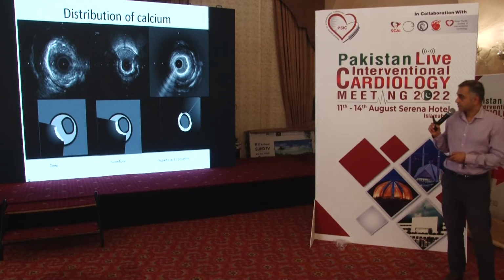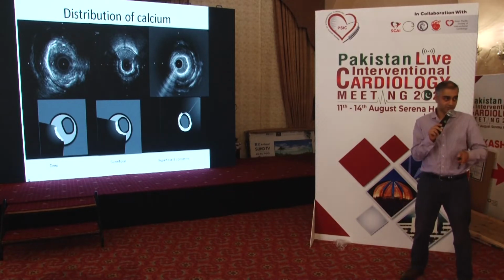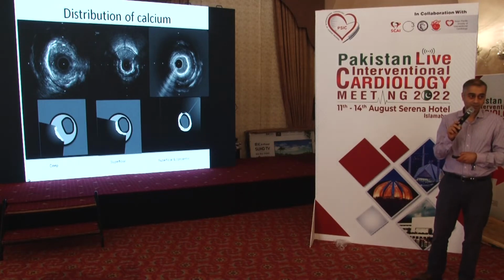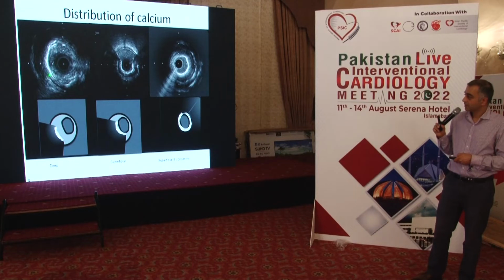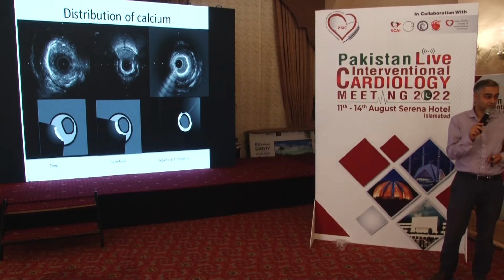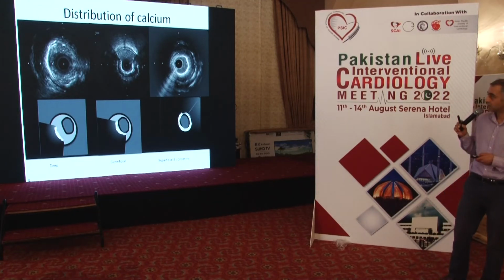So here's a slide which hopefully will answer some of the questions that you had in the previous session. So here, can you see, here you've got plaque here, but this calcium is deep. It's beyond the plaque. So this is deep calcium. And this is the schematic of that. And that's very different to superficial calcium as we just saw on the previous slide, but here's another example. And here you can say there's superficial calcium, it's probably around maybe 280, 290 degrees. Okay, so you just make a judgment on the degrees.